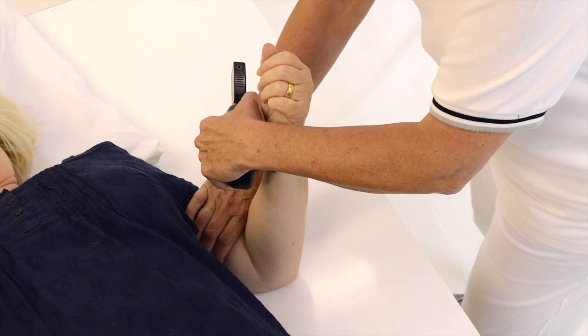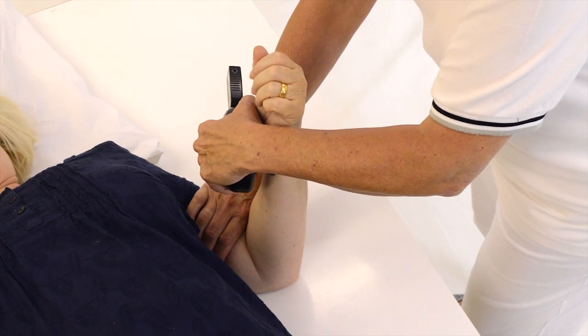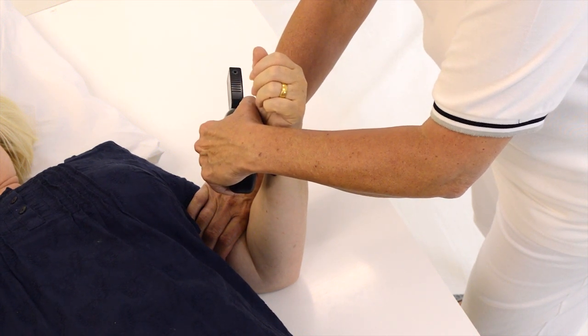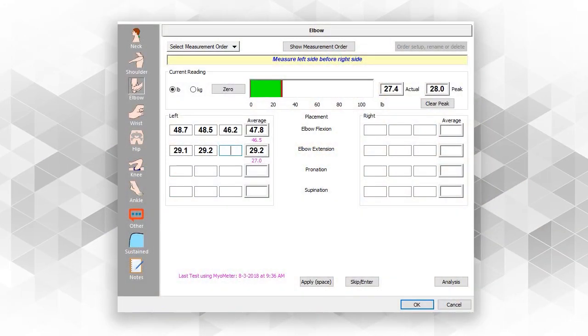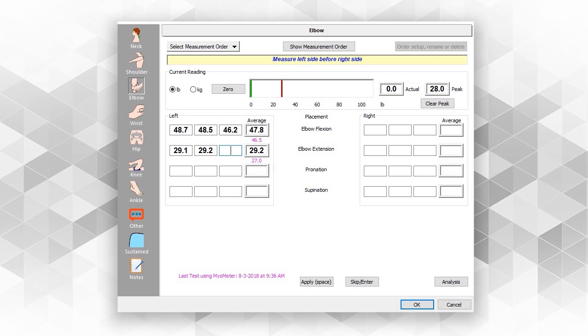The person is instructed to actively move through the test range and the clinician gradually applies resistance until the body part is depressed. The brake force is recorded and three repetitions generates a realistic average measurement.